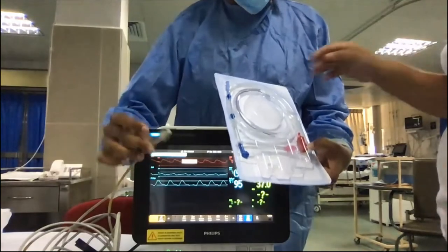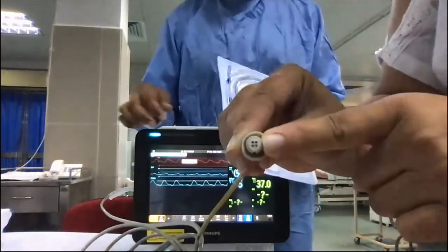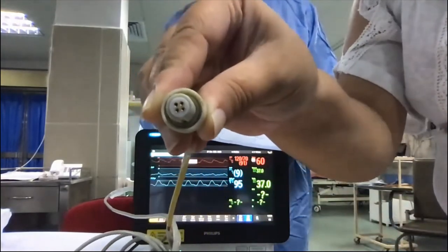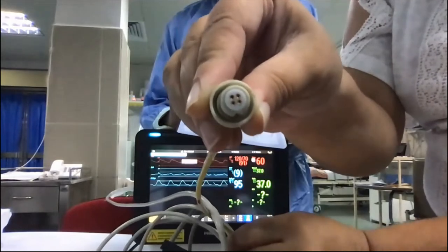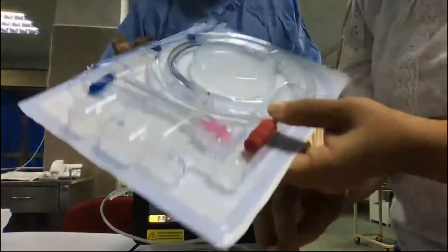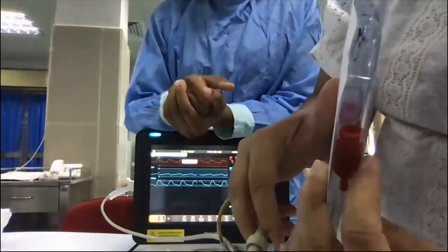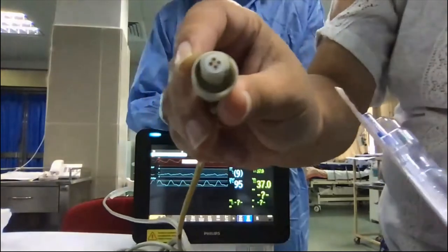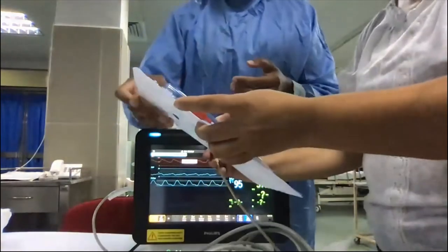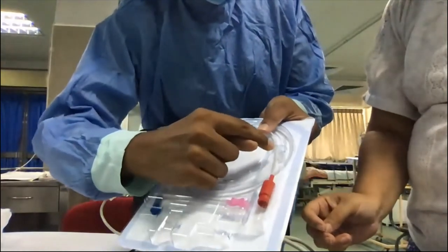cardiac output cable. I will just roughly show here, but I will go into detail so you can see. To identify it, you have four pins on this, right? So you can see there are four holes for pin insertion on this cable. It comes from the PiCCO Philips monitor. So it should go and connect to the red end of the femoral catheter. Can you see the femoral catheter and the big red end? It also has four pins inside, and this has the receiving four holes for those four pins, right? Then the other port, which goes to the other pressure transducer kit, is very near to that.